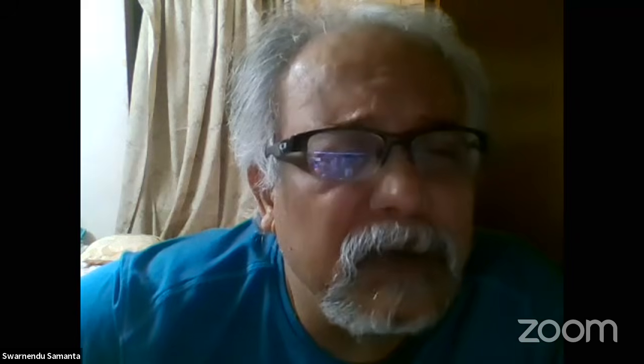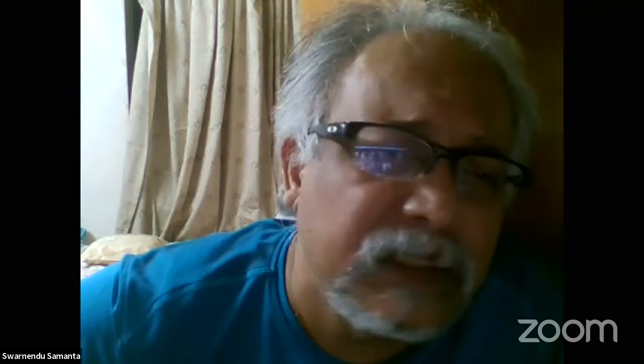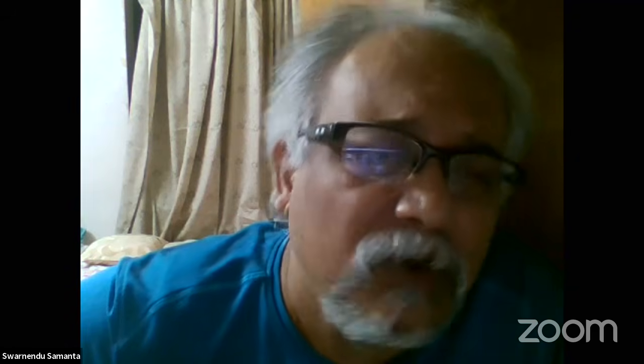This is for the juniors who are still wanting to buy a camera. I will request that you try to buy the autoclavable camera. Now there are autoclavable cameras as well. Then the problem with fogging and all these things is not there. Autoclavable lens and autoclavable camera, both are available in the market, and this is not very costly. If you know that, you will obviously buy the better one. Whenever you buy your phone, you try to buy the Samsung S9, S10. So why would you buy a Samsung S4? It is like that.